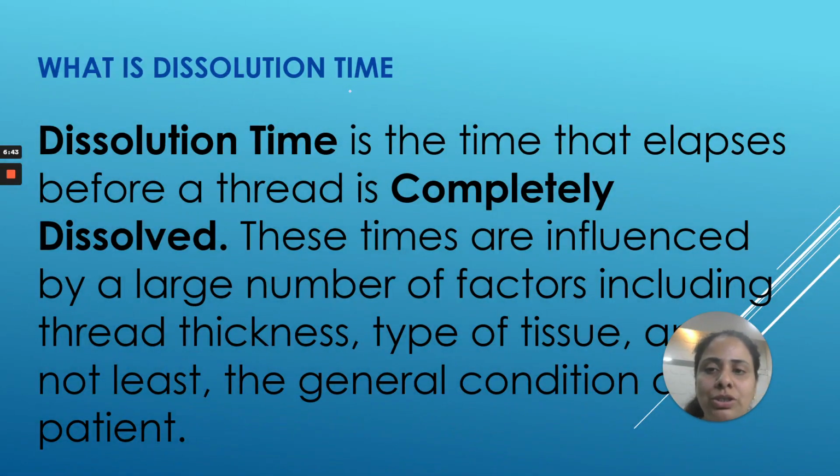So what is the dissolution time? Dissolution time is the time when a thread is completely dissolved. There is a very common problem I face in my practice, or anybody faces: patients ask me what kind of sutures I am going to place, whether resorbable or non-resorbable, because according to the general mindset, people think that resorbable sutures are better than non-resorbable sutures.